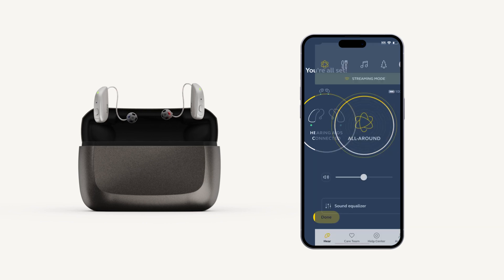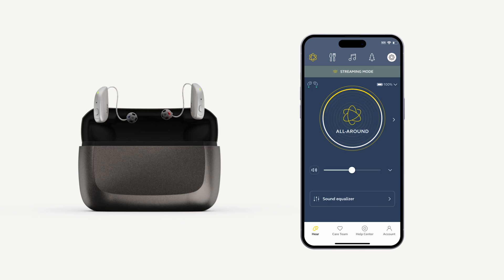You have now unlocked the use of our app and your hearing aids. If you encounter any error codes or need further assistance, please contact our care team.